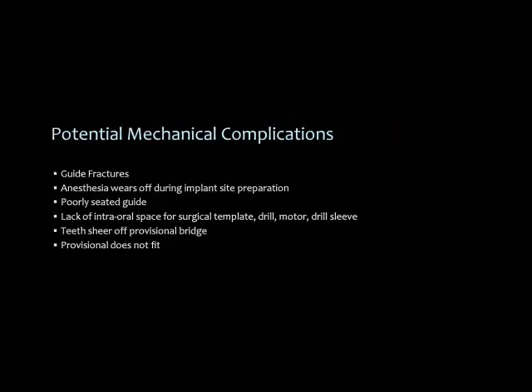But there's always complications to these types of things, and we all have to be aware of these complications so that we can avoid them or be aware of what we should do when they do occur. So there's guide fractures. The surgical guide can break. Again, you have to design that when you're designing a radiographic template to make it thick enough so it doesn't break. During the surgery, the anesthesia can wear off. Try to use a long-lasting anesthetic or sedate the patient.